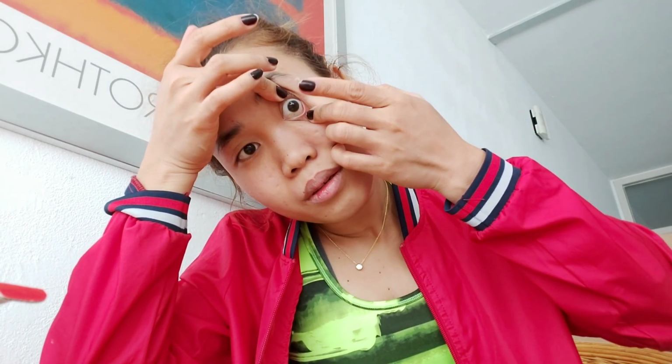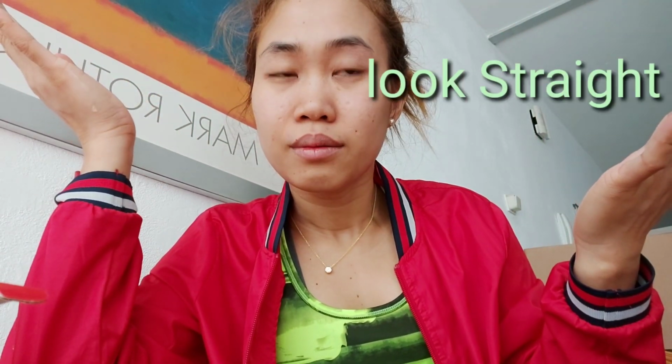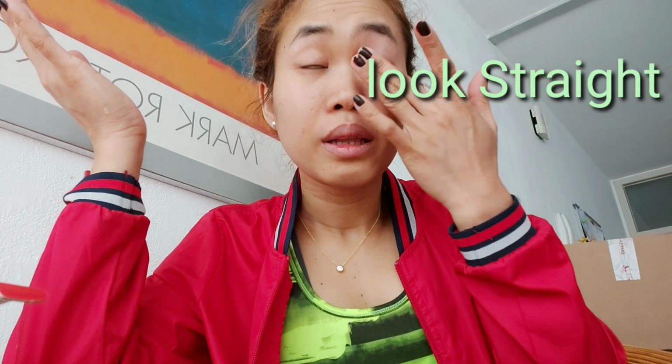And then with your left finger, scary eyes, guys. Don't be scared of my eyes. It's just a demo. You should do it like that, guys, while holding it with your right finger, index. I think it's thumb and index. So do it like that, and make sure that you're not going to blink, so it will be easy for you to put it on. That's it, guys. Just make sure to blink, and that's it.